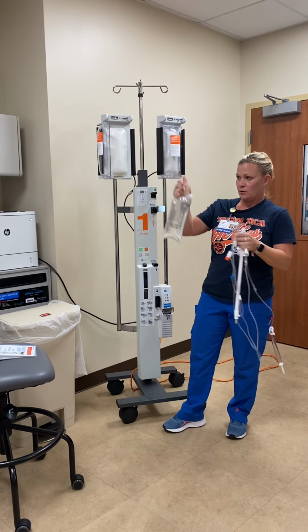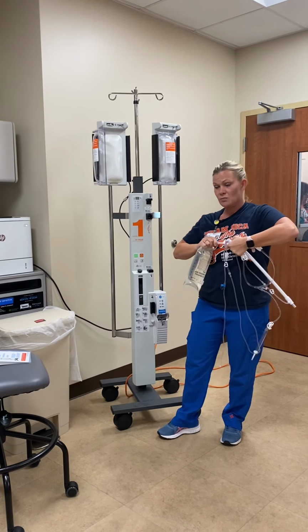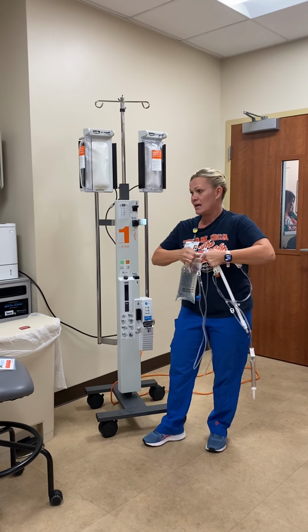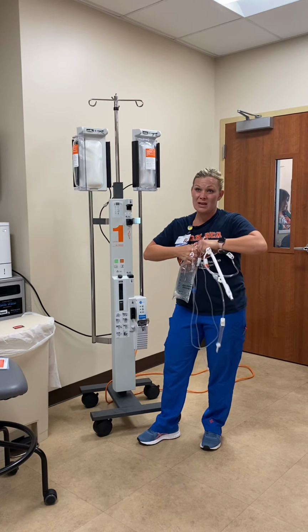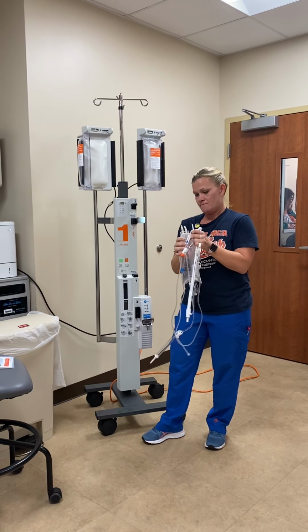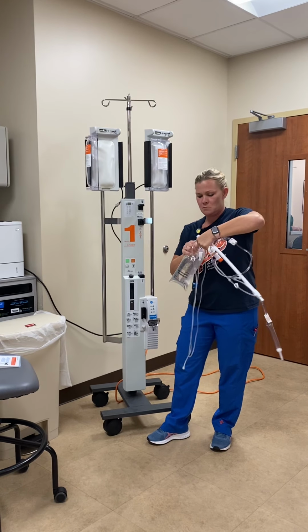When you spike your fluid bag, you want to spike it, and then get as much of the air out of the bag itself as you possibly can. Otherwise, as your bag empties, it'll start pulling the air through, and then you'll have to start over with priming and running everything through. And it's okay, it's a trauma room, you can be messy.